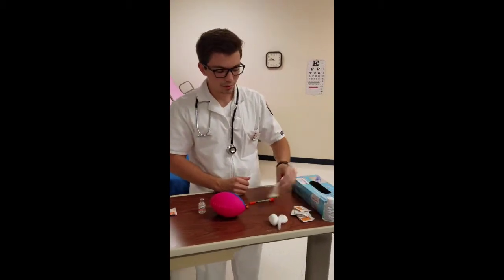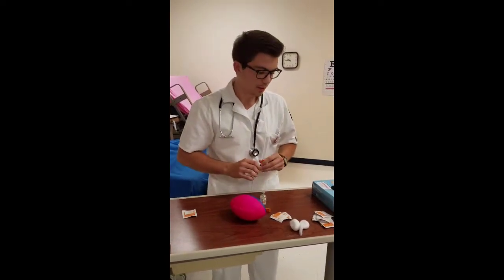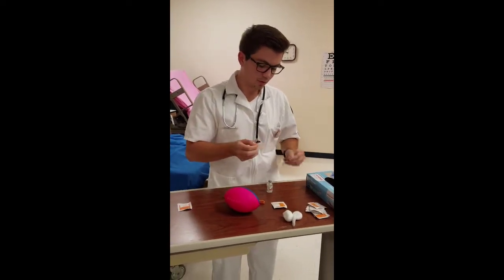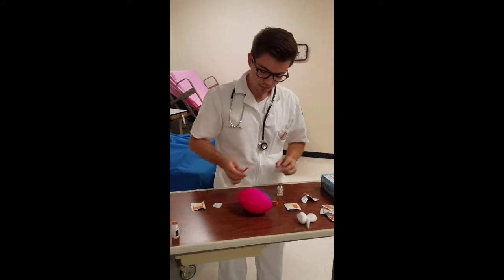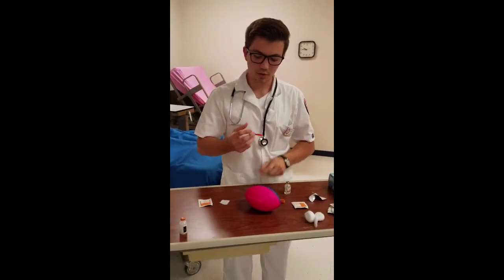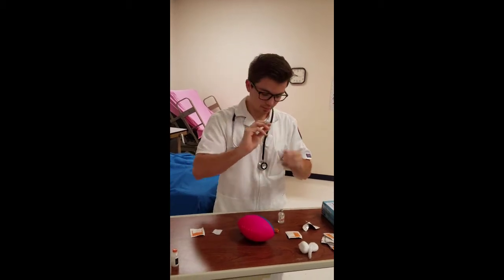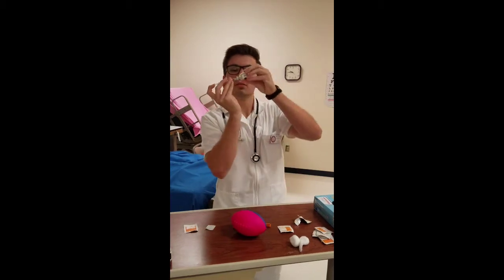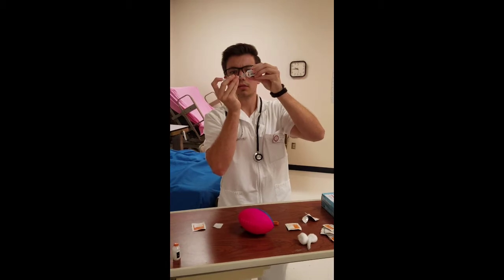So to do this, we're going to go ahead and have to withdraw our insulin. We're going to take the cap off of the insulin. We're going to disinfect. Then we're going to get our insulin needle ready. We're going to draw back for the 2 units. Insert some air in there, and then withdraw the 2 units of insulin.